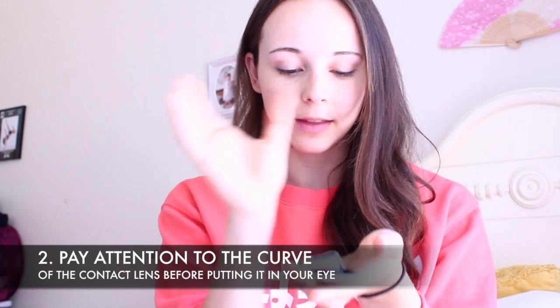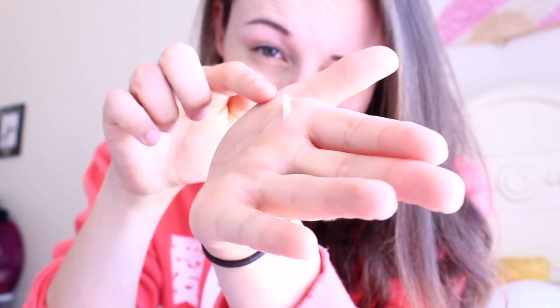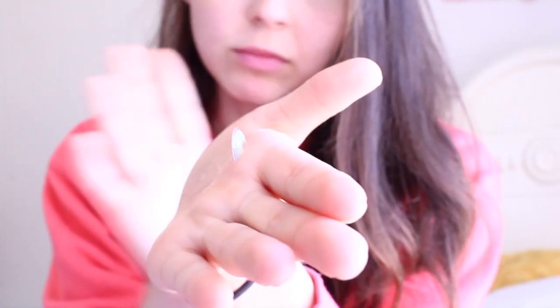Tip number 2, always pay attention to the way that the contact lens is folding, because there is a particular way it's supposed to curve. So if it's flipped the wrong way, it's going to have these little lips on the side, and that's going to be really uncomfortable. So you have to make sure to look for that. If you can see this, it's more of a circular shape. If it's flipped on the wrong side, you'll see that it starts to curve and then it kind of flips on the wrong side. So that's bad.